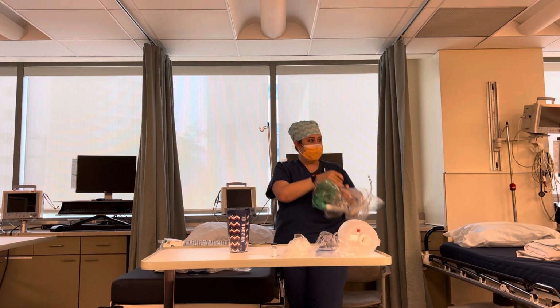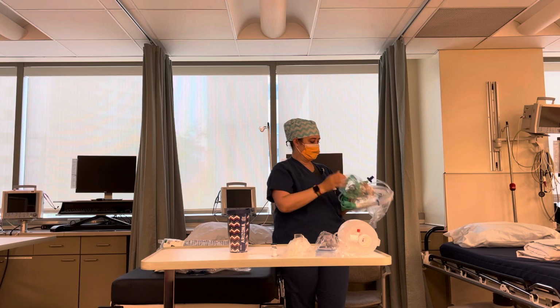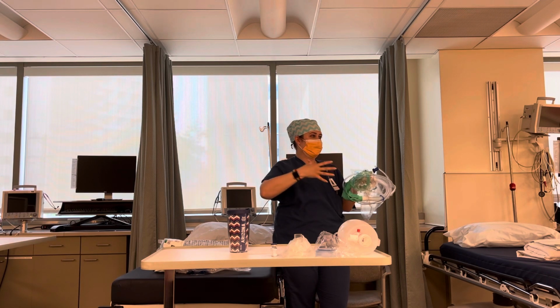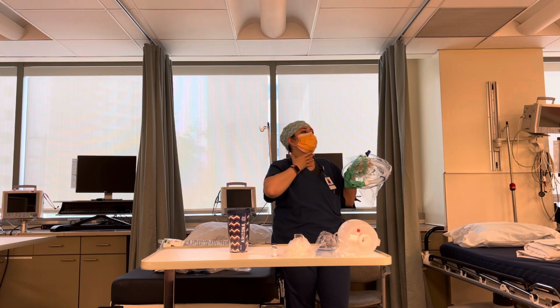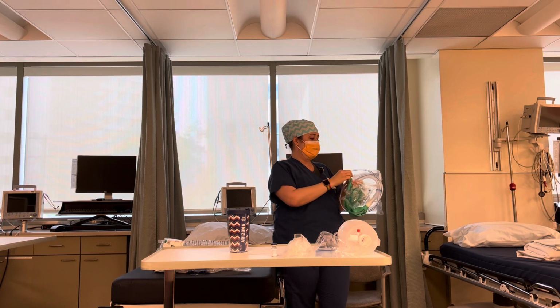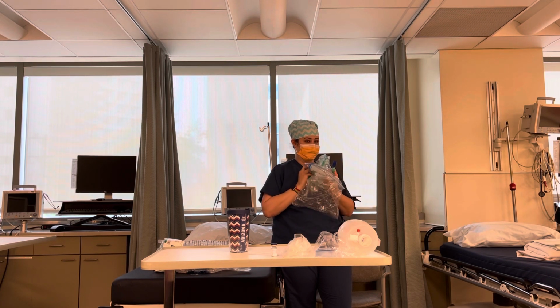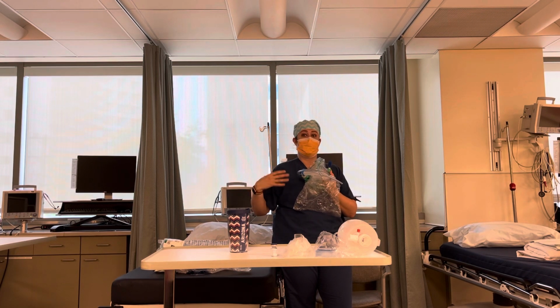This is the valve to give positive pressure. You can open or close it. That's how much pressure and force is going to be in this bag, putting positive pressure on those vocal cords to pop them open so that they break that spasm. We should always have it turned to off so that the second we put it on the patient in an emergency, it's already giving the full amount of positive pressure.